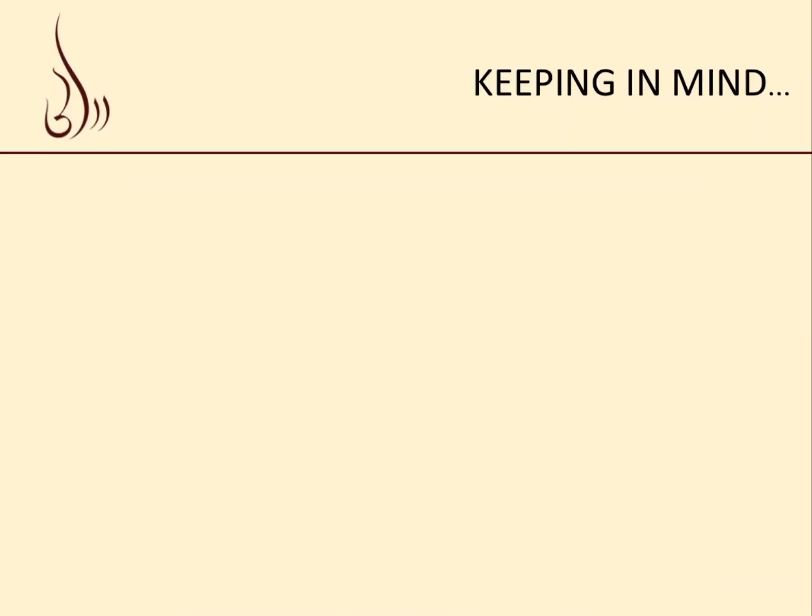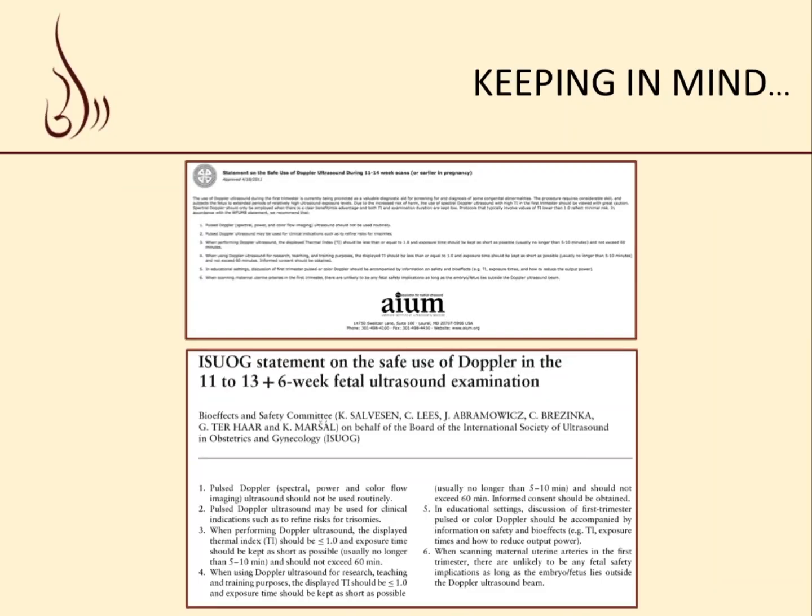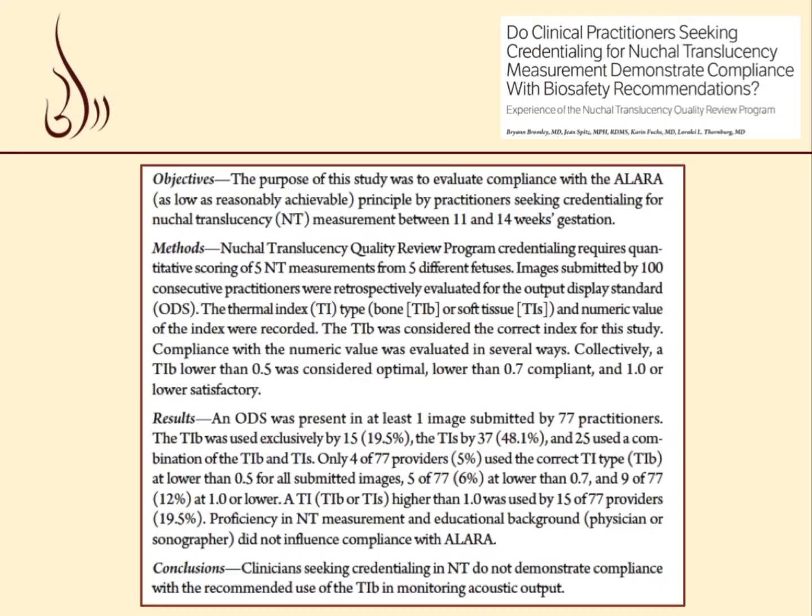You have to keep in mind safety. Anytime we're working in the first trimester, it is very important to be mindful of safety concerns, particularly when we're employing Doppler. There are safety statements issued by both the AIUM and ISUOG, and we have to adhere to the ALARA principle.